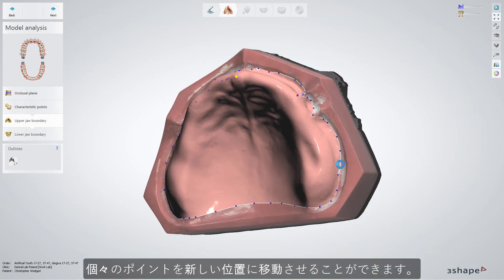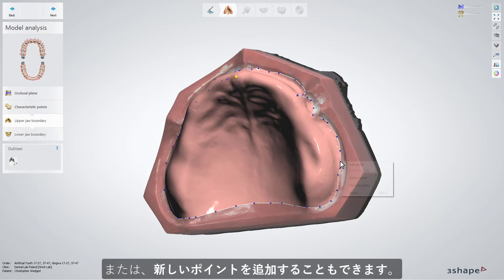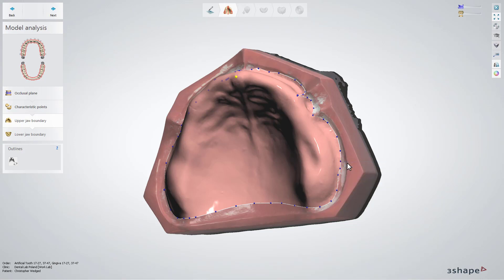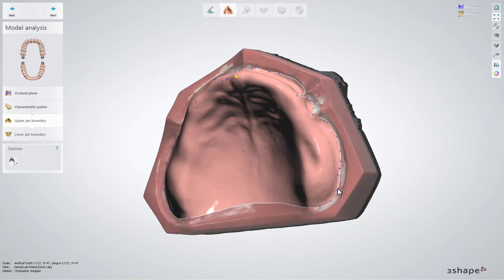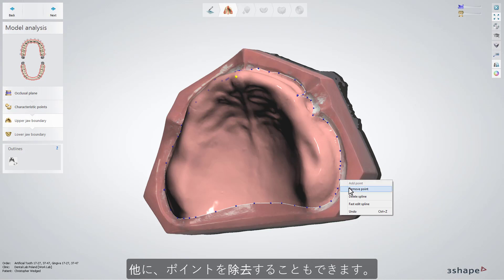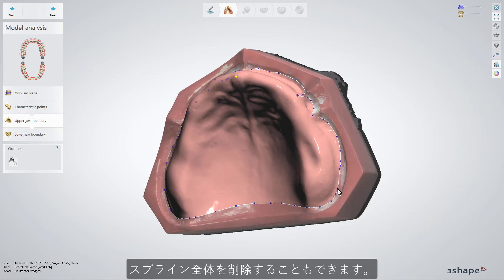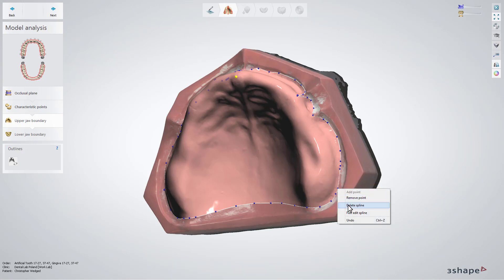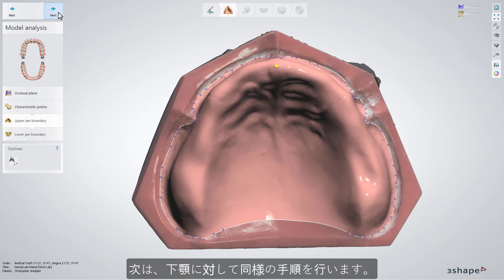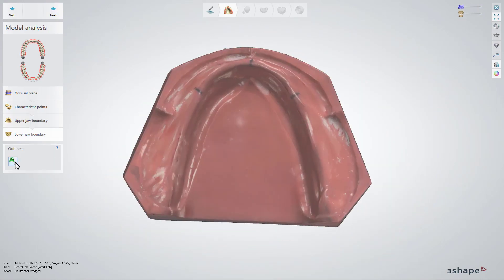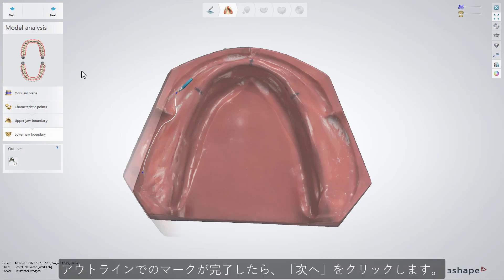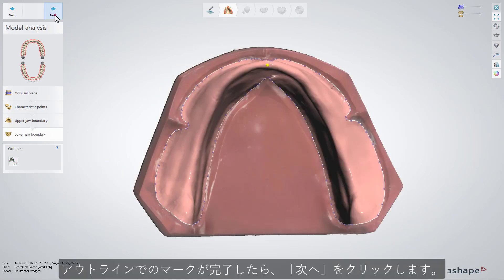You can move separate points to a new position, add a new point, use the fast edit spline to easily reposition the outline, or remove a point or delete a whole spline. Now do a similar procedure for the lower jaw. When you have the outlines marked, click Next.